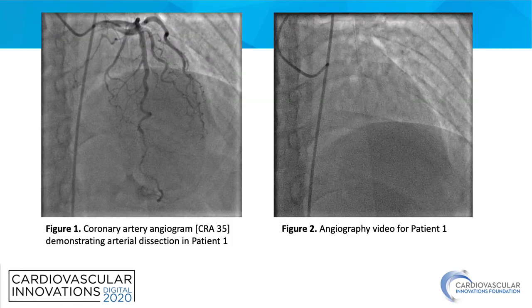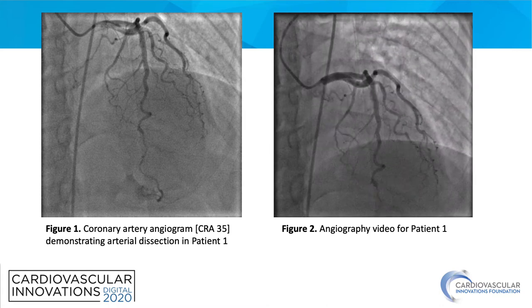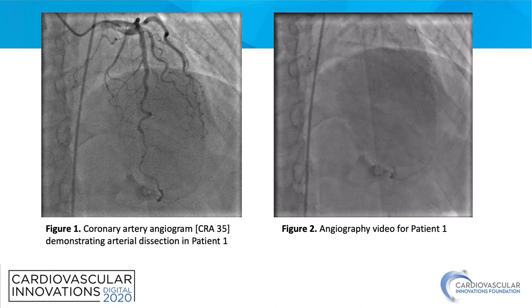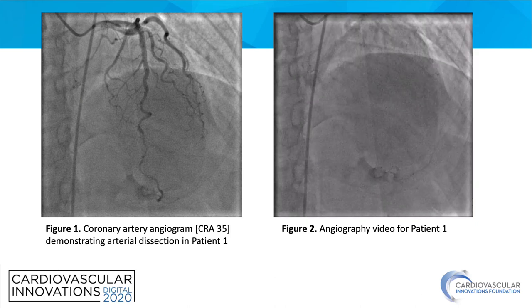Here we have figure 1 and figure 2. Figure 1 is the coronary artery angiogram for patient 1, and figure 2 is the angiography video. The cranial projection of patient 1's angiogram shows a variation in lumen size, most notable in the mid to distal segment, which is very consistent with a spiral dissection. Also, the blush of contrast that we see is extracardiac — that's kidney calyces. The angiography video for patient 1 confirms the spiral dissection.